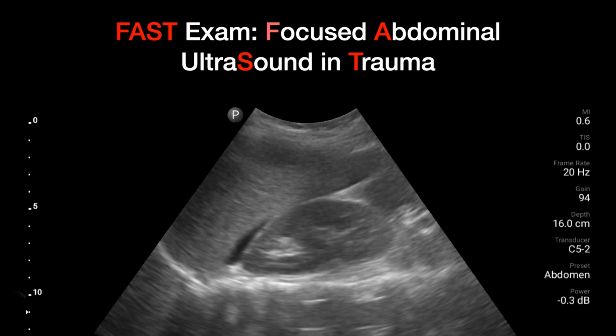Now, there is an exam you might have heard of called the FAST exam, or the focused abdominal ultrasound in trauma, looking for fluid. In medicine, we do the same exam, basically. The cause of fluid, though, usually isn't intra-abdominal bleeding. It's often ascites from heart failure or cirrhosis or other causes. And here you can see a small little strip of fluid in the hepatorenal space, or Morrison's pouch. And this is where we look for that.